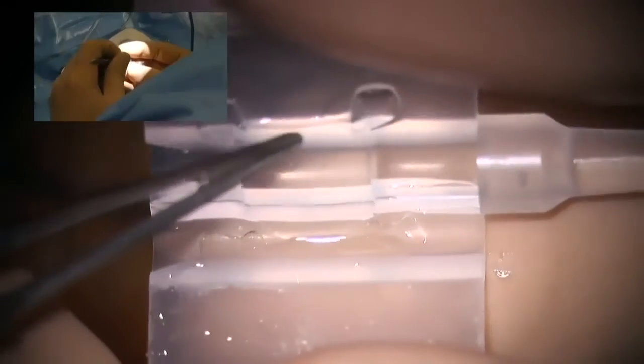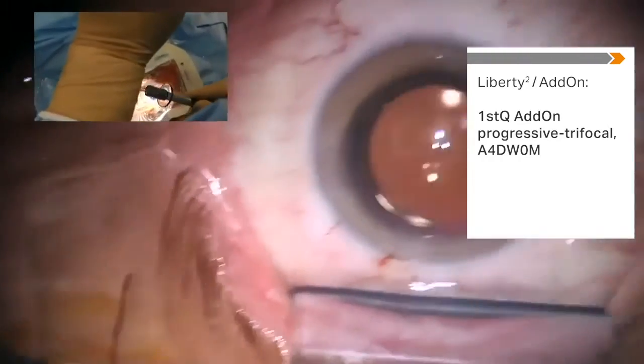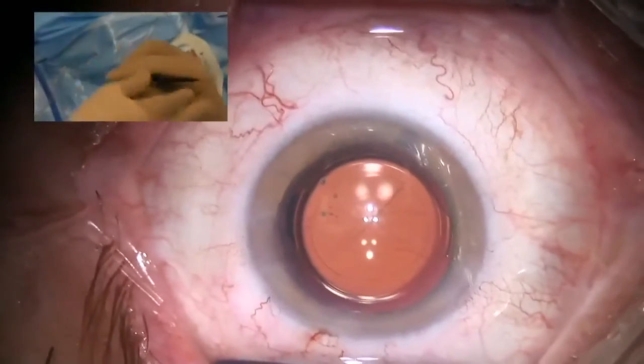Okay. Again, the add-on IOL in the Liberty system, the proper alignment of the IOL in the cartridge, folding backwards, avoiding the incarceration of the haptics, slight pressing down. If you hear this clacking noise, if you close the cartridge, then you are on the right side. If you don't have a noise, then you probably have an incarceration of a lens particle.